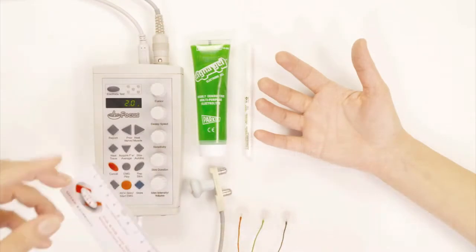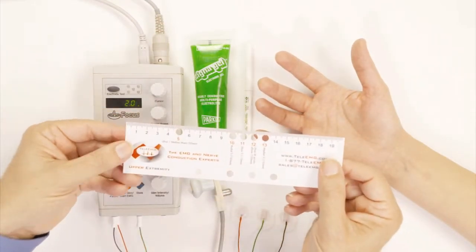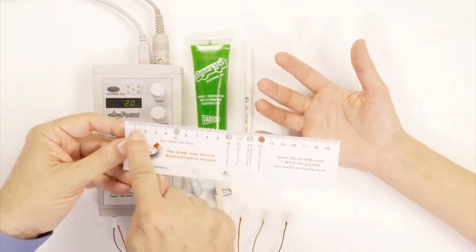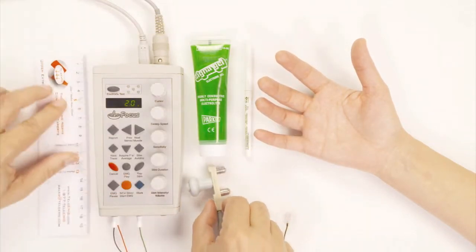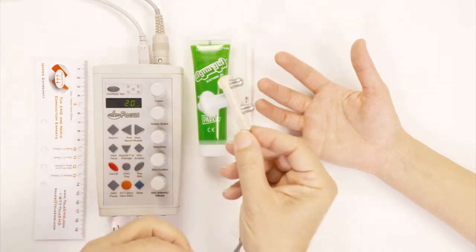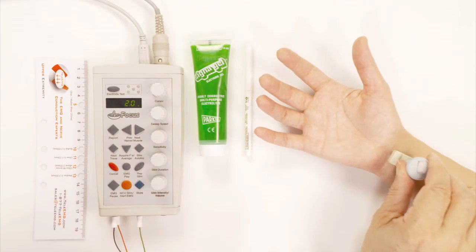So the first thing we're going to do is I'm going to introduce to you the fact that we're going to use a ruler. The ruler is going to tell us what distances we should use to stimulate the nerve. The second thing I'm going to show you is the stimulator. The stimulator is where we actually apply the stimulator to where we're stimulating the nerve right here.